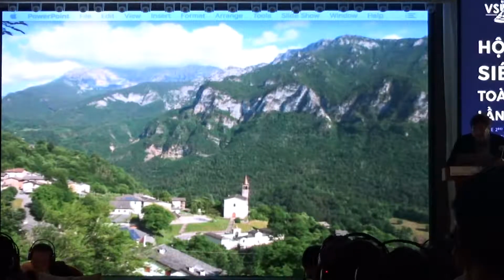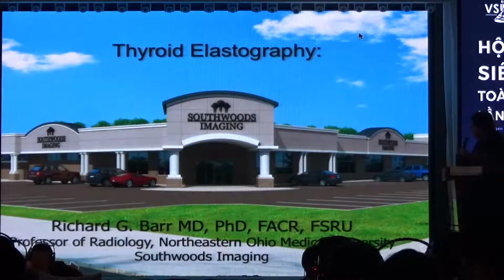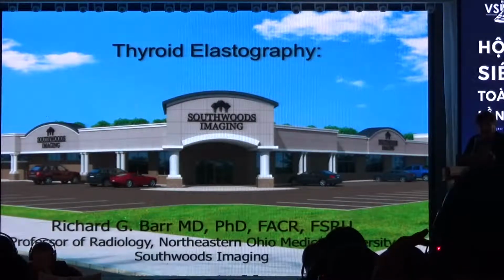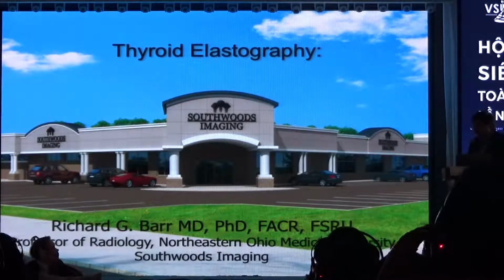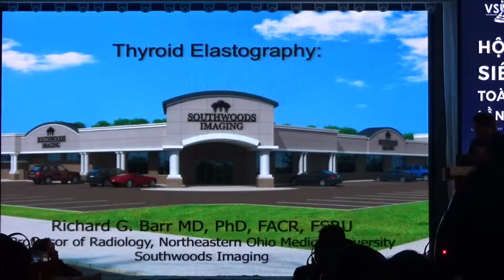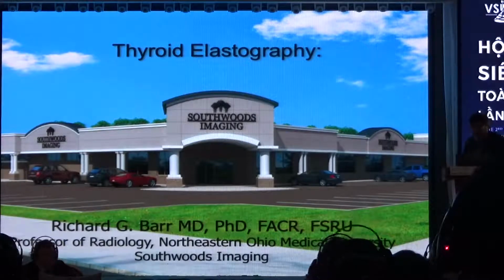Okay. So I'm a very, very big believer in breast elastography, and like I said, we do this in every one of our cases, and we feel very confident when we cancel a biopsy or tell a patient it's benign. Unfortunately, I'm not quite there yet with thyroid.